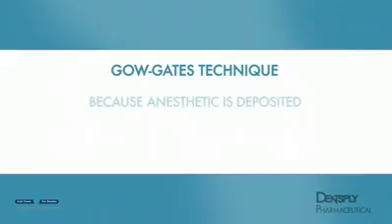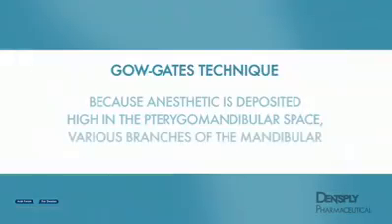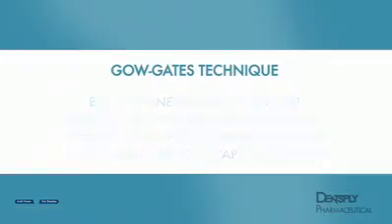When properly performed, the Gow-Gates block offers some advantages over the standard inferior alveolar nerve block. Because the anesthetic is deposited high up within the pterygomandibular space, it is less likely that various branches of the mandibular nerve, which may provide anomalous innervations of the mandibular teeth, will escape being bathed in anesthetic solution.